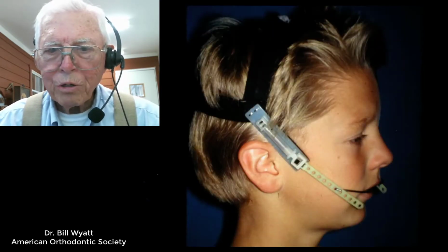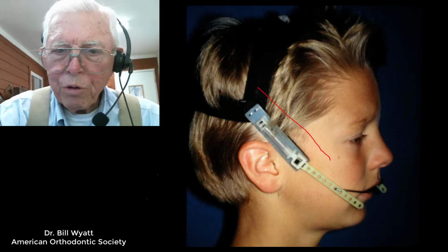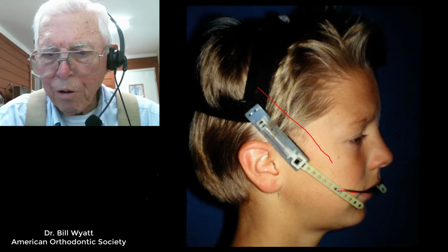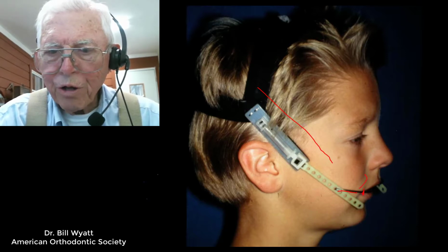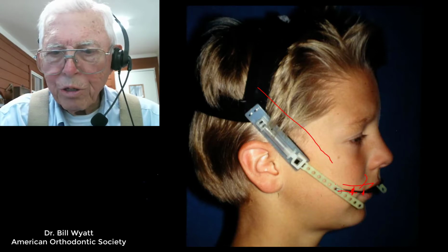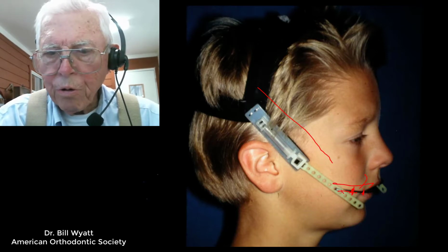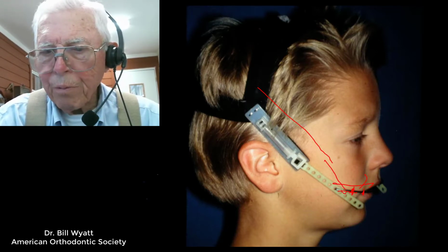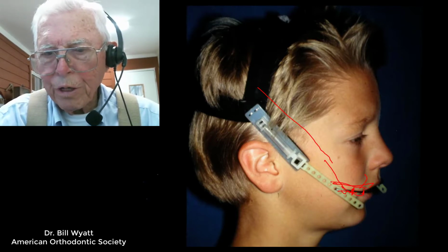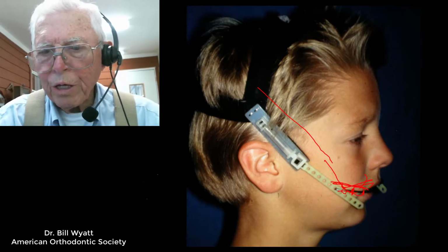Now we use an occipital headgear. We used a lot of tubes, and you can cut that bar here, right here, and raise the front teeth, or you can cut it along here, and it'll just raise the whole arch up, or you cut it back here to just pick up the molar area. And the upper arch can be raised different ways.